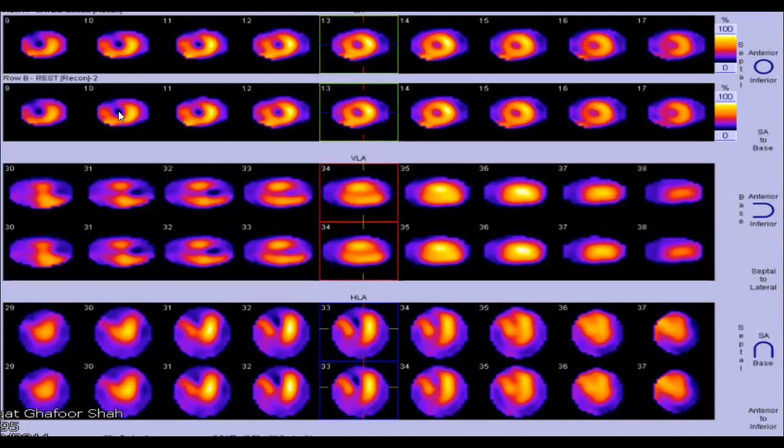So where is the defect located? I think a few segments are missed here, because starting from 9, the apex is missing. So we consider there is apical anterior, then mid anterior, and then there is some defect here in the septum as well. So it's mid anteroseptal, apical anterior, and likely apical septal as well.